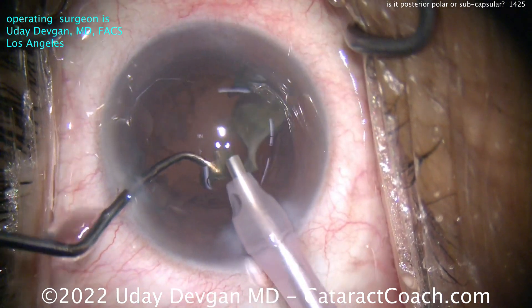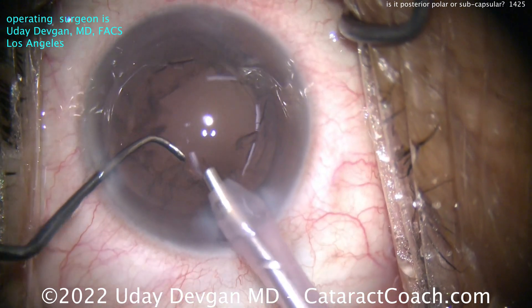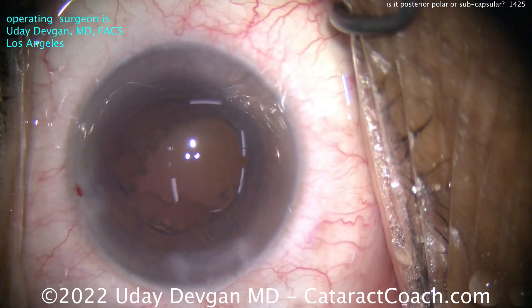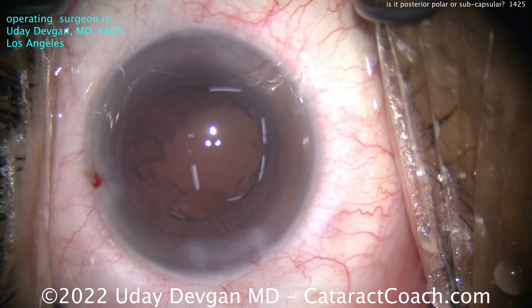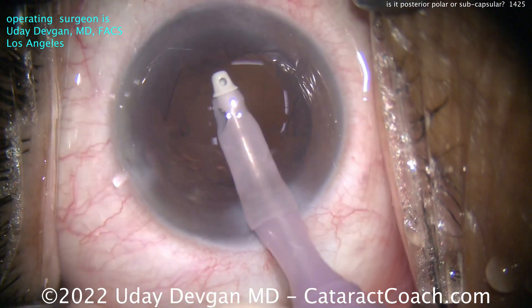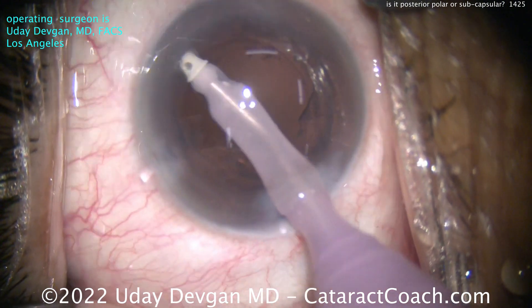Here's the last piece — and you know what, it's looking pretty good. Now I can take a peek back there and say: looks like it's a pretty reasonably intact bag. Everything was fine; I don't see any issues. So — hey, it was a PSC. I made the right decision. I show you this case because I want you to know that even after tens of thousands of cataract surgeries there'll be cases like this where I question it.